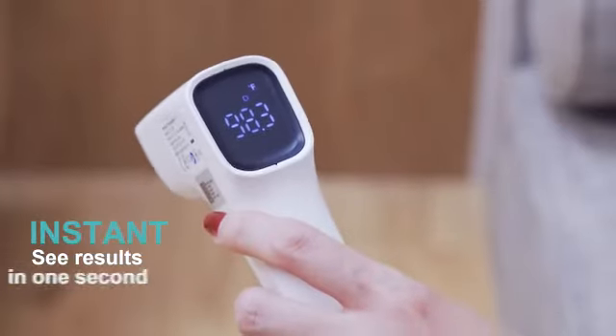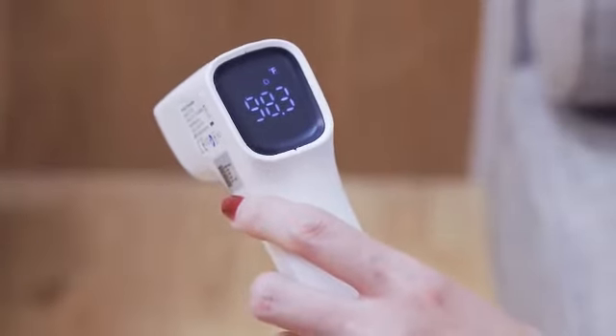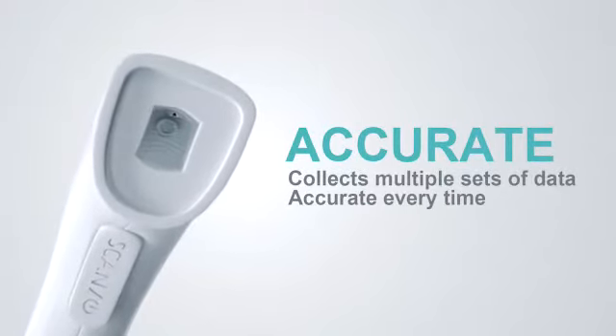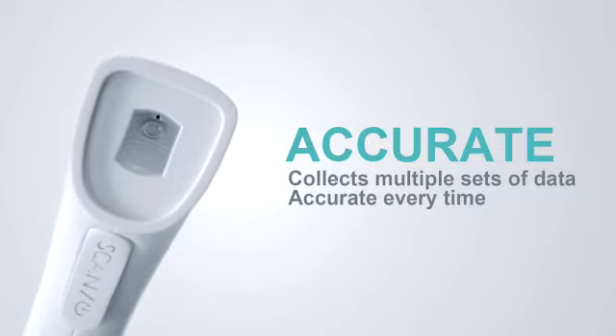Easy results in just one second. The infrared sensor collects multiple sets of temperature data automatically. Get accurate results every time.